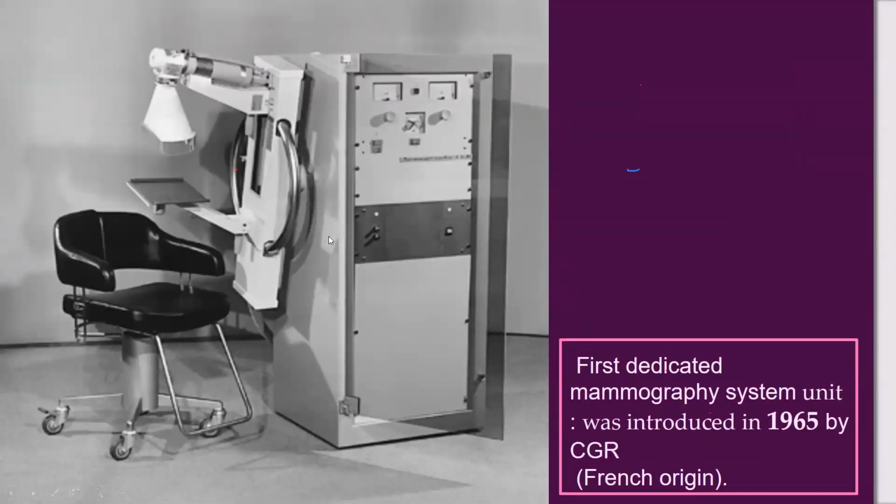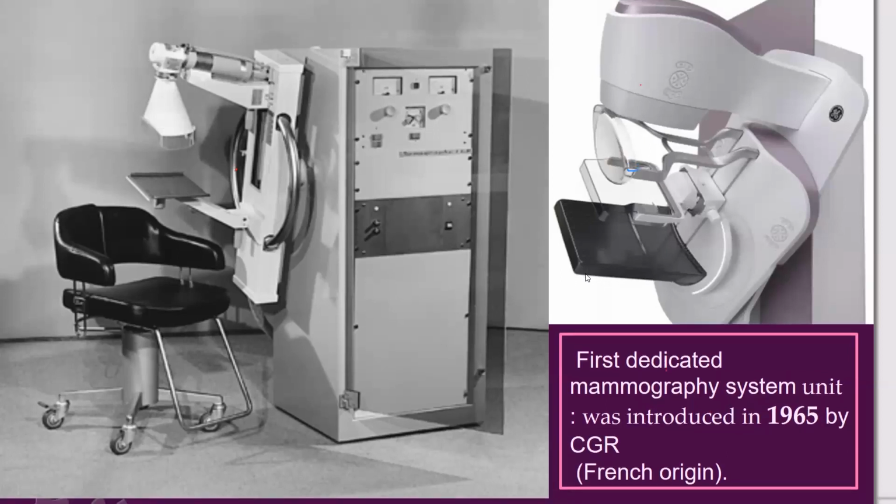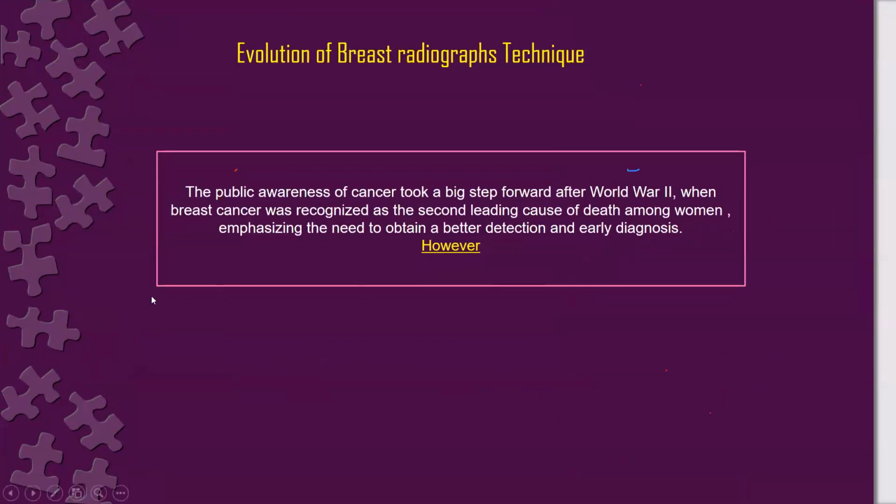This is the first dedicated mammography system unit, introduced in 1965 of French origin. You can compare it with these new machines. The public awareness of breast cancer took a big step forward after World War II, when breast cancer was recognized as the second leading cause of death at that time, emphasizing the need for better detection of early cancer.